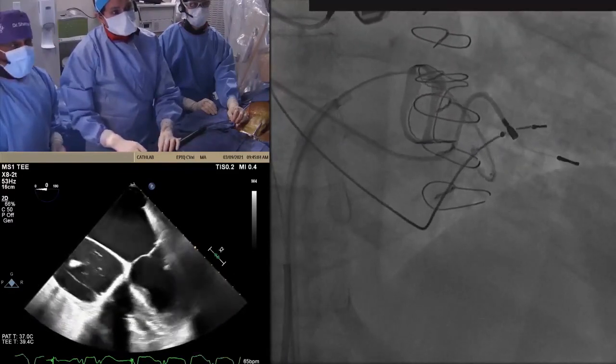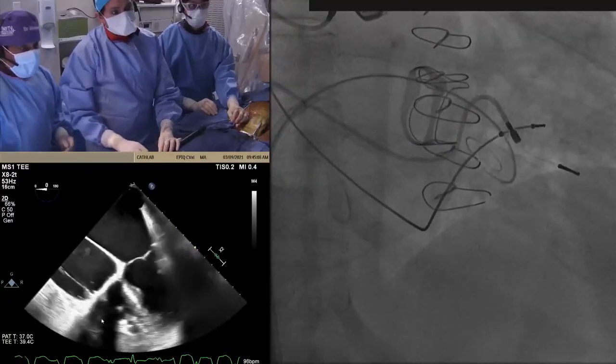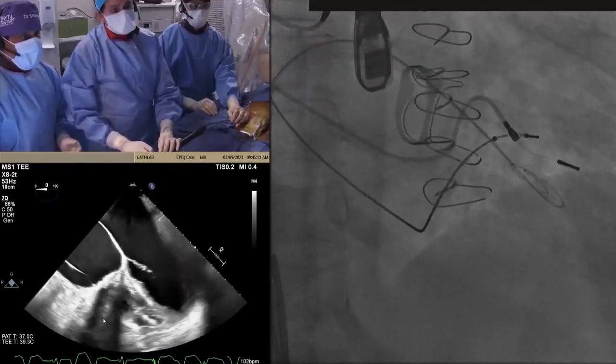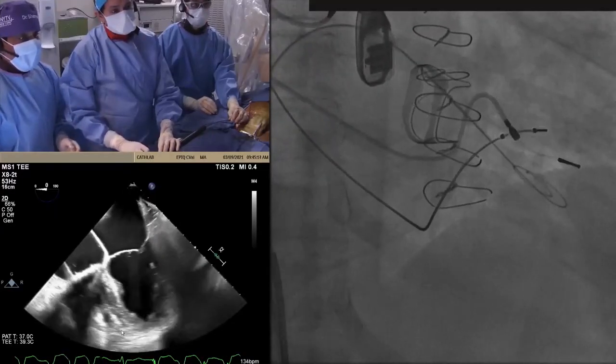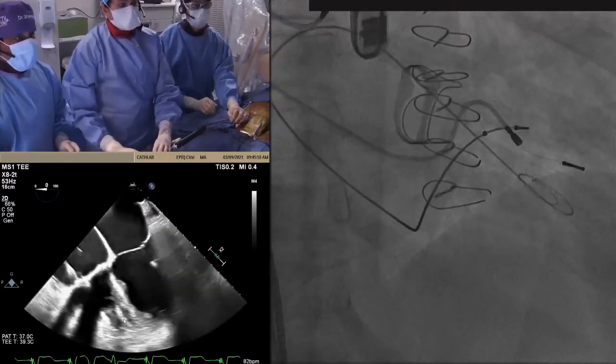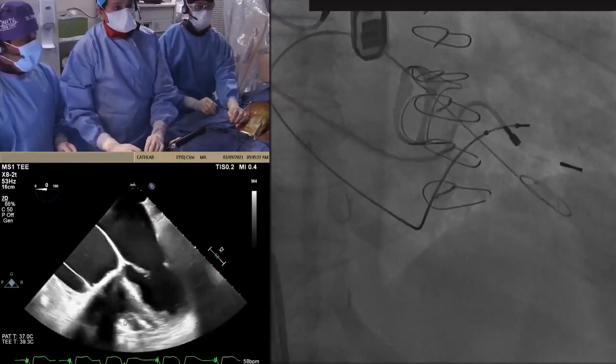Nice cross, Kini. Here we go. Now just push the Safari. Push it fast. Yeah. Good. Nice. We were in the same place as before. No. Now, right, better. Here you go. This is better. Looks better. Yeah, see there, see there. Marco, you see there. So far, okay.